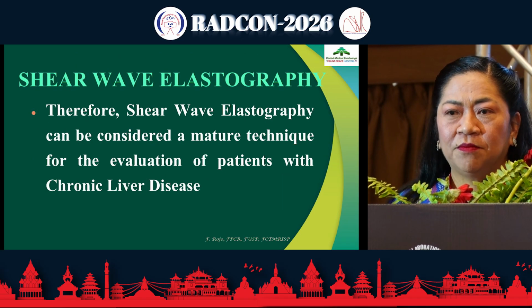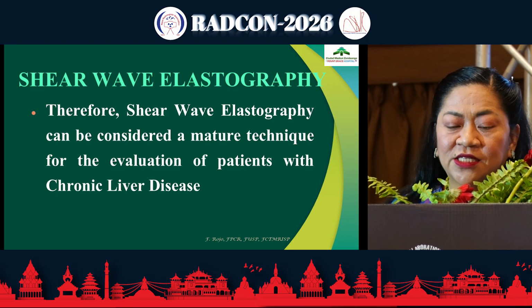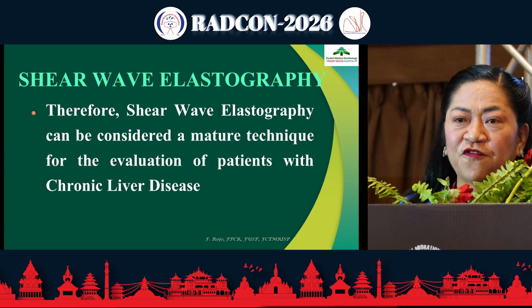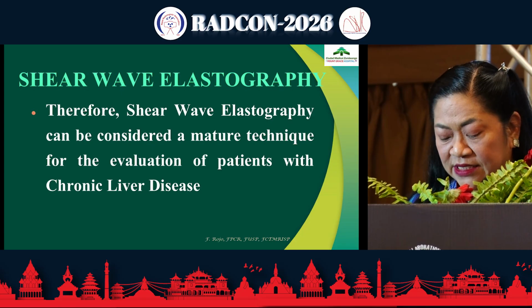So aside from liver elastography, we also have now new ultrasound-based biomarkers, and that is for quantification of liver fat content. And this is because they said that there's now a steatotic liver disease epidemic.